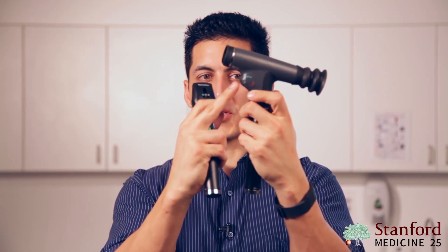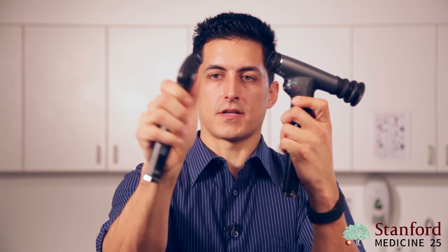The panoptic scope is very similar to the more traditional direct ophthalmoscope — this knob correlates well with that knob, and the nearsighted/farsighted setting is the same idea. One advantage of the panoptic is that if you're a very nearsighted healthcare provider, you usually don't have to worry about the patient being nearsighted or farsighted unless they are extremely so. With the traditional scope, you may have to adjust it more for the patient.